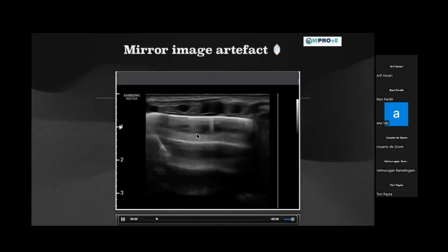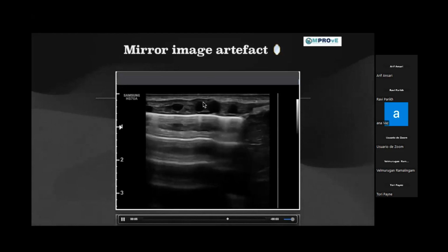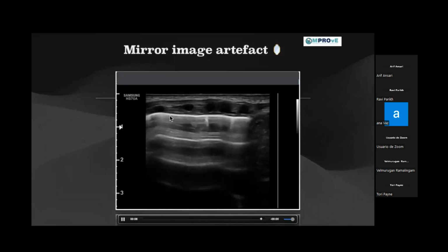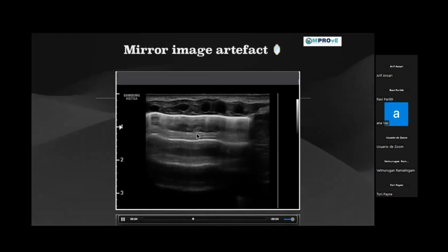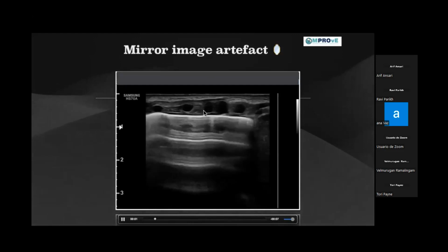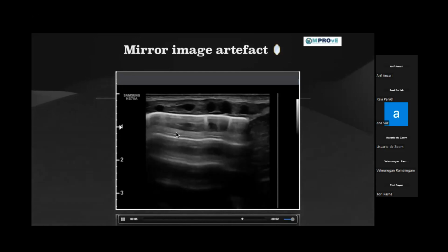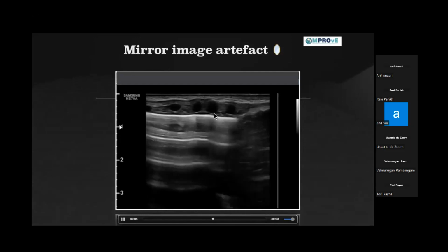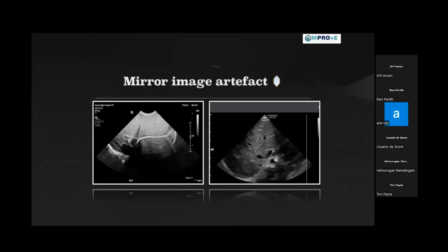Yeah. So what is wrong over here is my angulation. I have not angled the probe perpendicular to the pleural line. Of course, there is some lung coming in the picture, which is from the adjacent lung. There will be some lung somewhere. The pneumothorax is not a global thing in this baby at the moment. So there is a pocket of air somewhere which is reflecting all these waves. But at the same time, there will be a juxtaposed lung as well. So that is giving you this. So it becomes imperative that you get the bat wing sign before you interpret the image. I hope I have not confused you guys further.